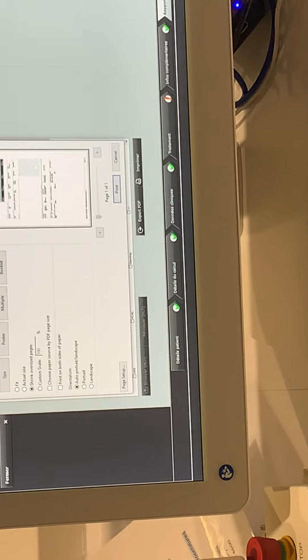What we did, let me print that. Instead of writing, let me print that for a short second. I will show you. We have these stickers here. This is from the last time. What we did with Dr. Leiberman was here, or you can put it here. There is enough space on your report to put your sticker on it. Okay? That looks cool. It is possible. But this is at the moment a raw one, because there are no details in it, because it doesn't make sense to print the report before you finish the treatment. That was only for you to have a look at. We will see that later.